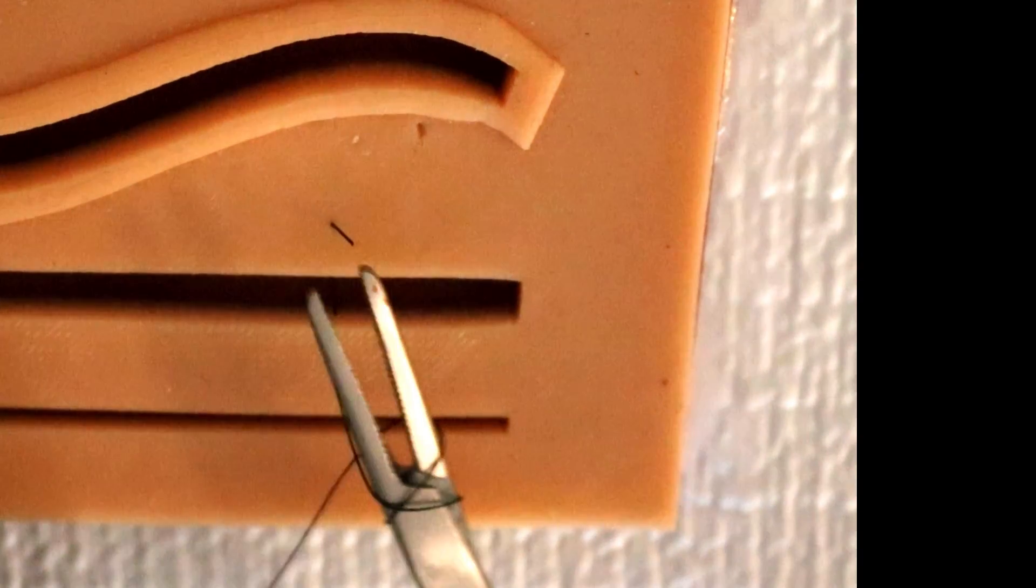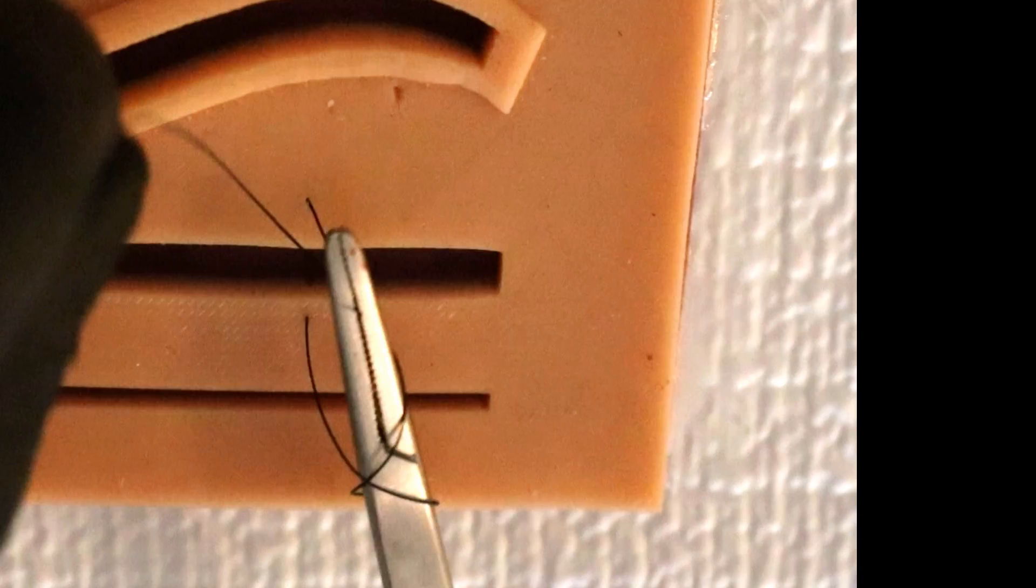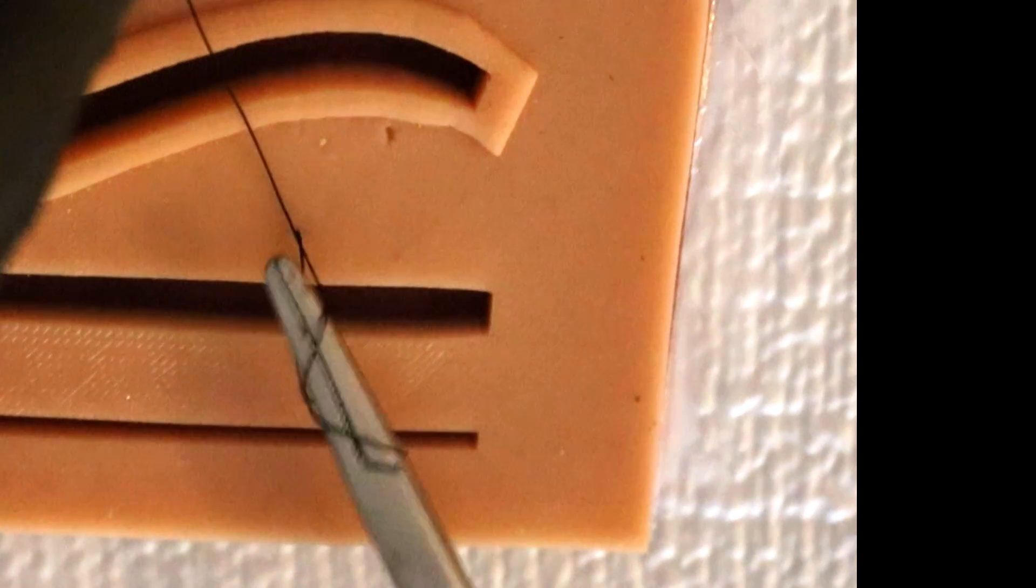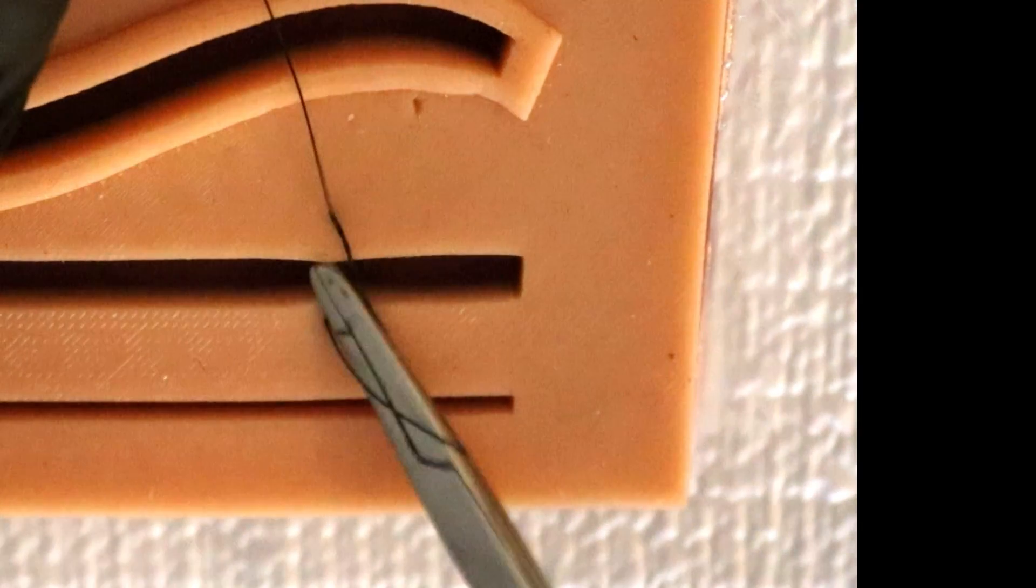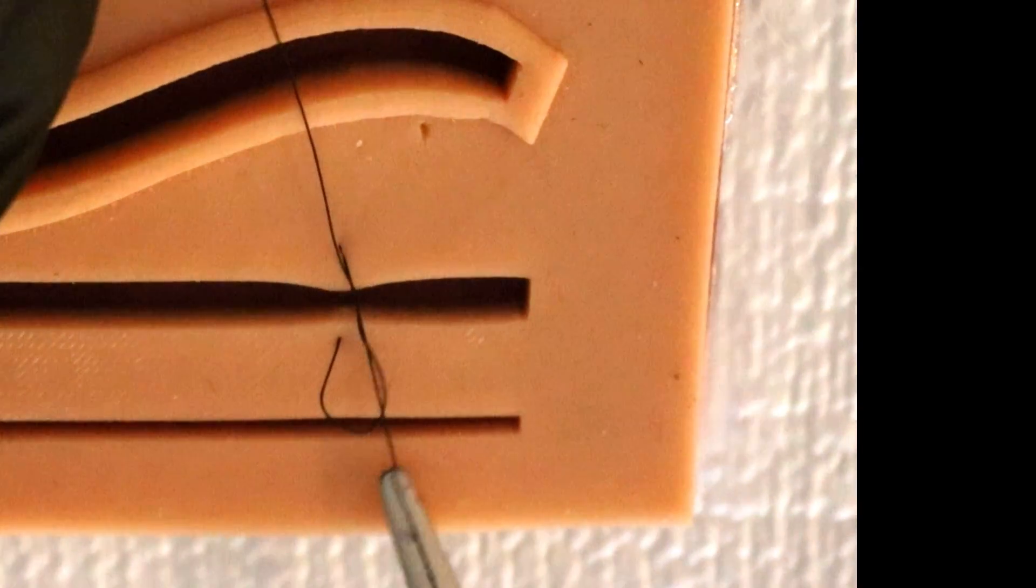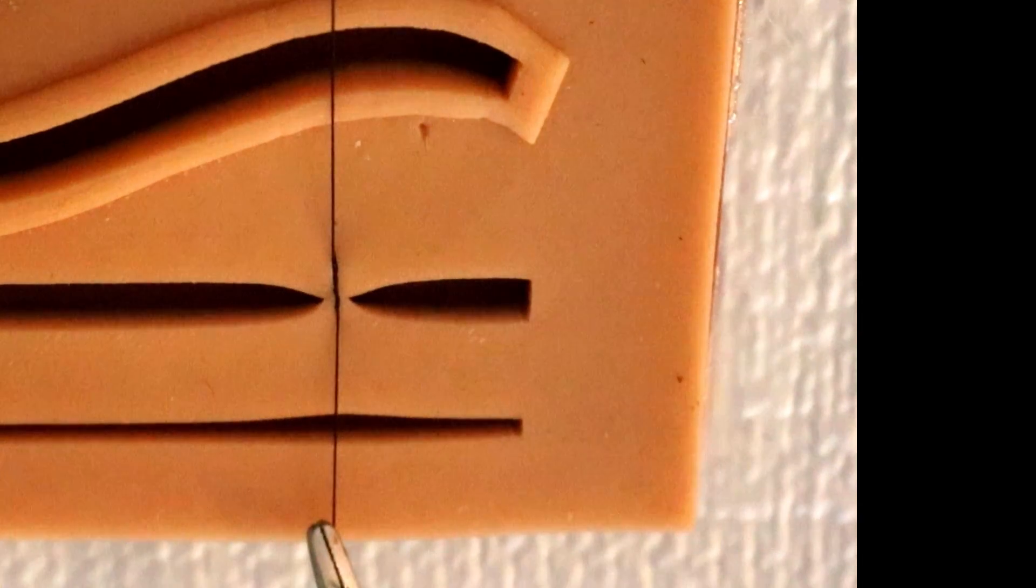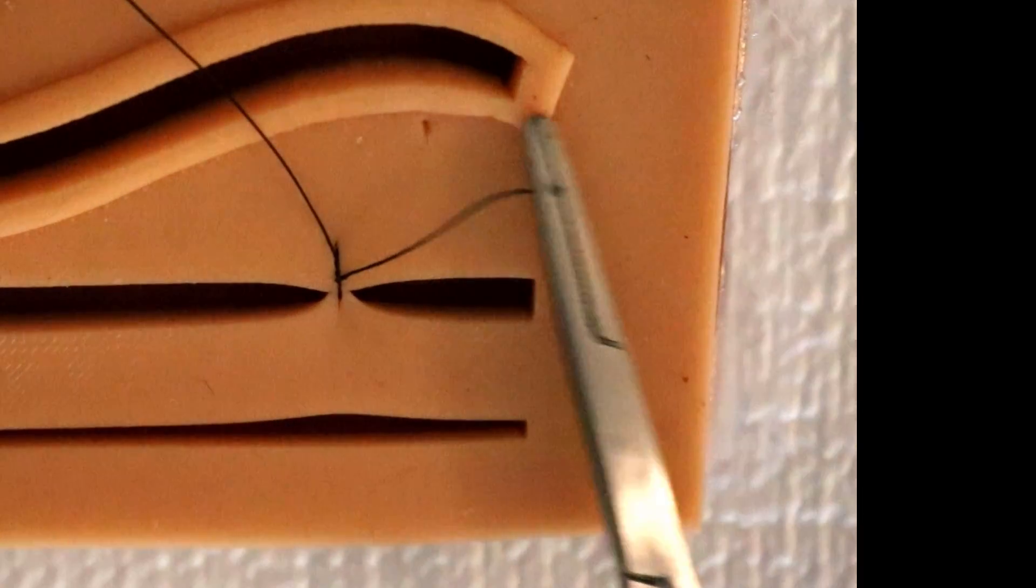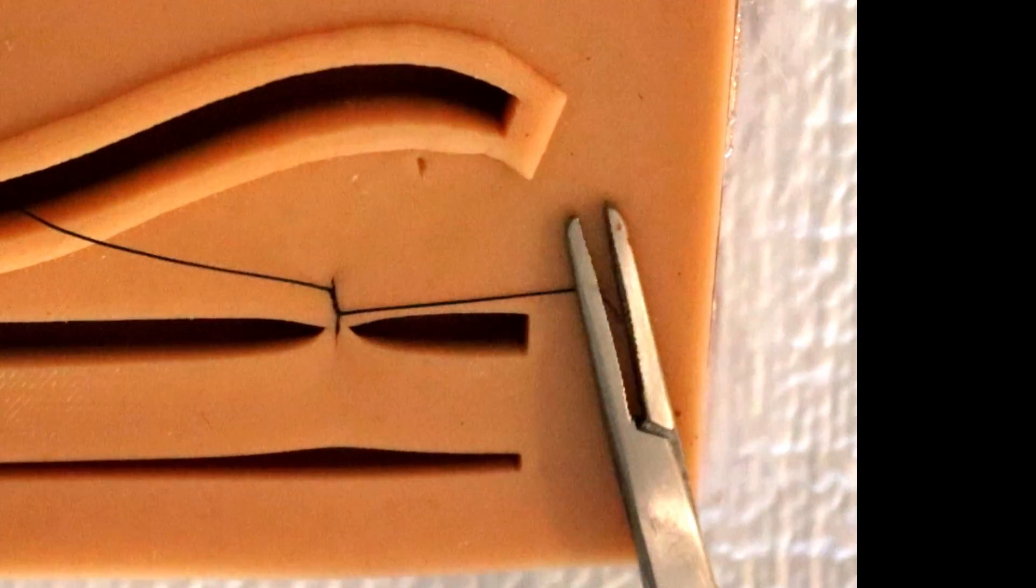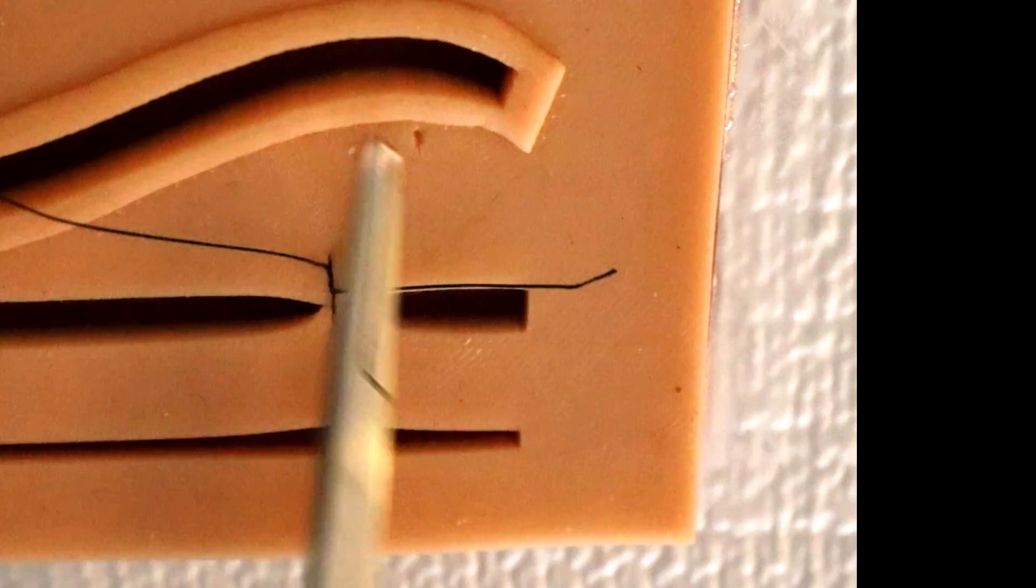Grab and then you're gonna go opposite ways with your hands. And that's gonna be your first throw. Remember we're doing three to four and as we saw the research four is the best. So go ahead and tighten up a little bit. You don't want to invert those edges. Remember you want to keep them everted so don't clamp down too much on that. There we go. That's your first throw.